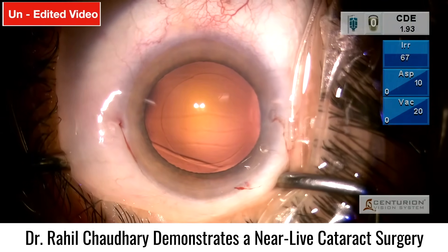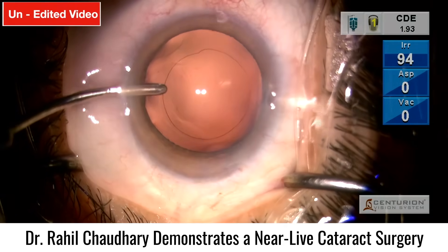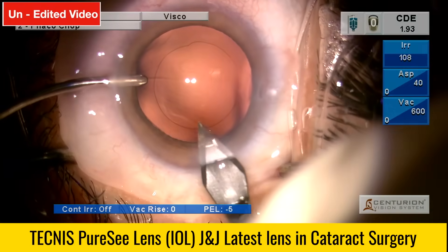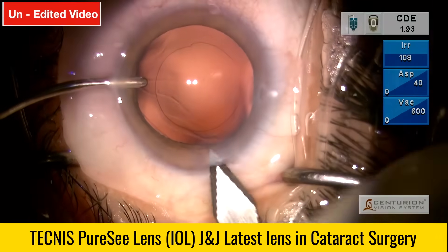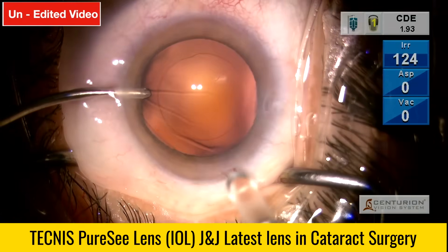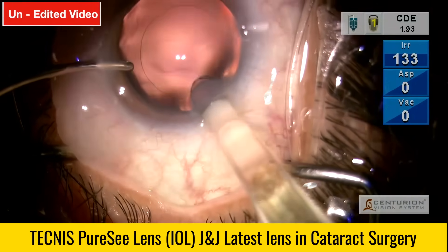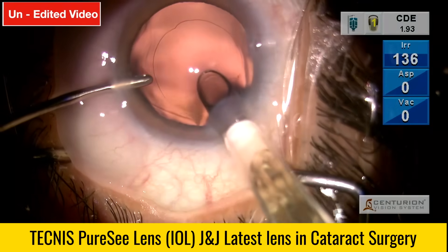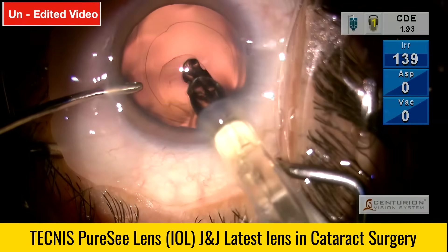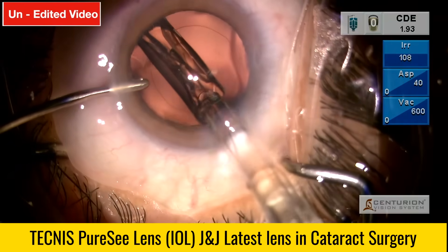Now proceeding with lens implantation using the hydro-insertion technique. As mentioned, the injector which comes with the lens requires a 2.8 mm opening, so extending the incision here. Hydro-insertion works really well for me, especially in torics — it gives better stability post-operatively. The lens goes in nice and smooth, like a breeze, similar to other Tecnis platform lenses we are used to using.